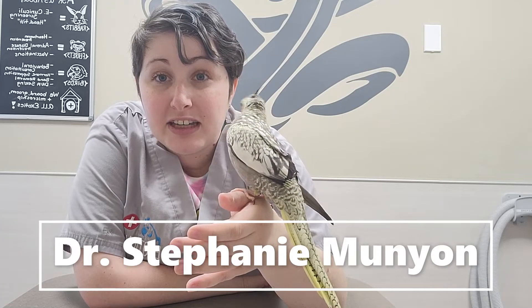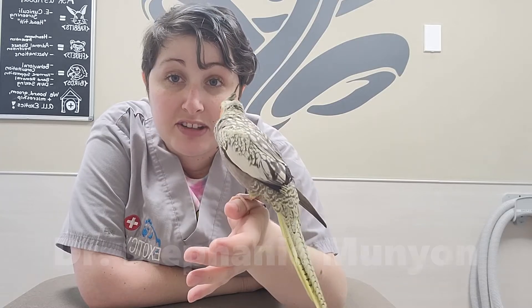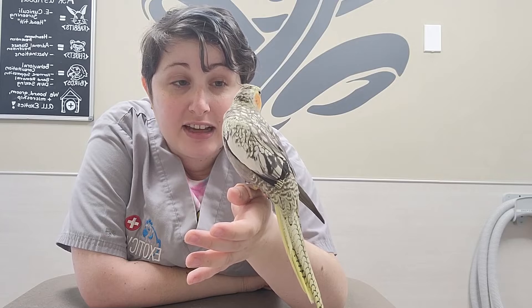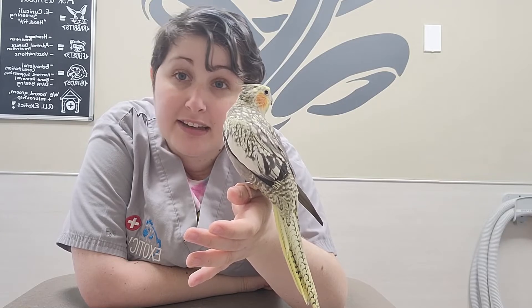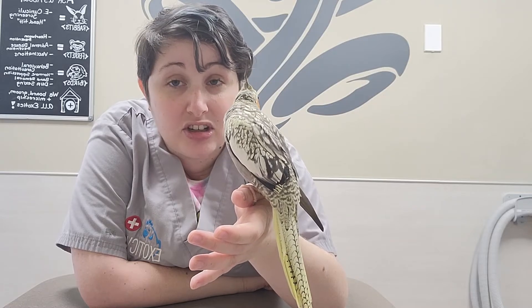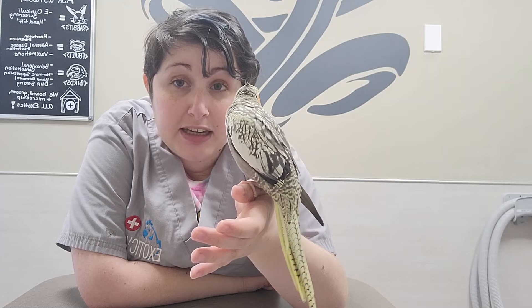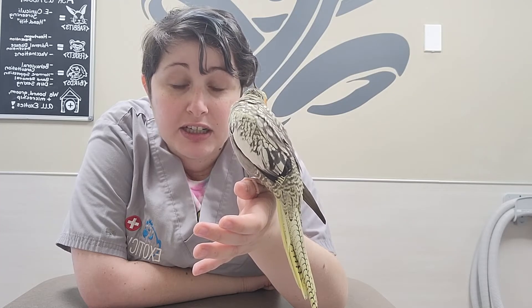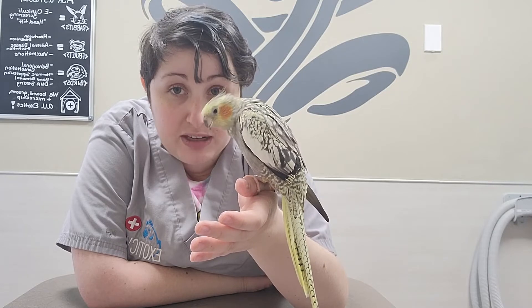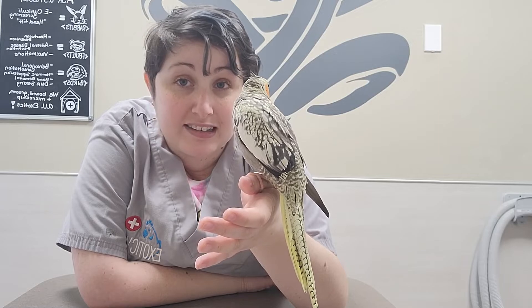Hey, this is Dr. Munyon with Exotic Vet Care. Me and my assistant Phoebe are going to show you how to give intramuscular injections in a bird. You may have to do this to either give long-acting antibiotics, an anti-inflammatory, or even arthritis medications to your bird. We'll go through the appropriate anatomy for knowing where to give the injection, and then we'll restrain Phoebe and show you how to administer the injection itself.